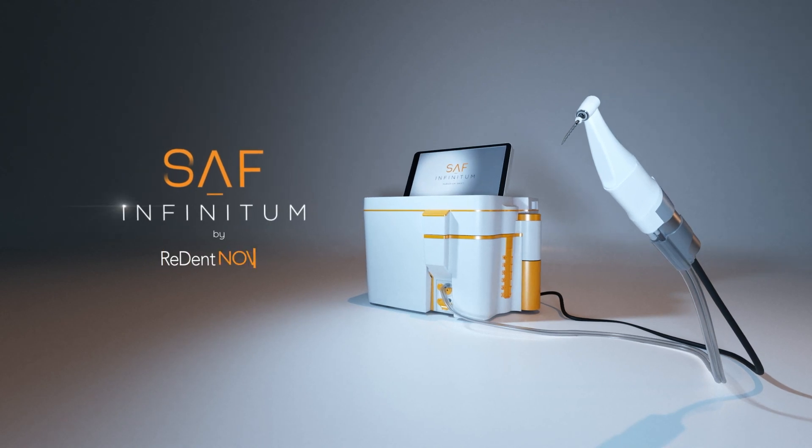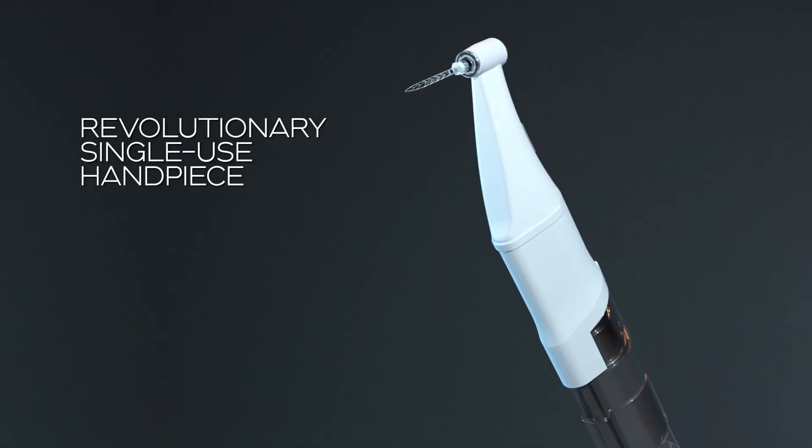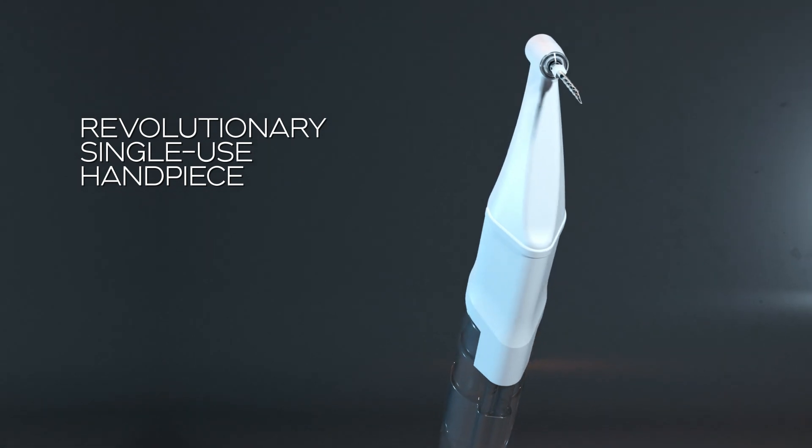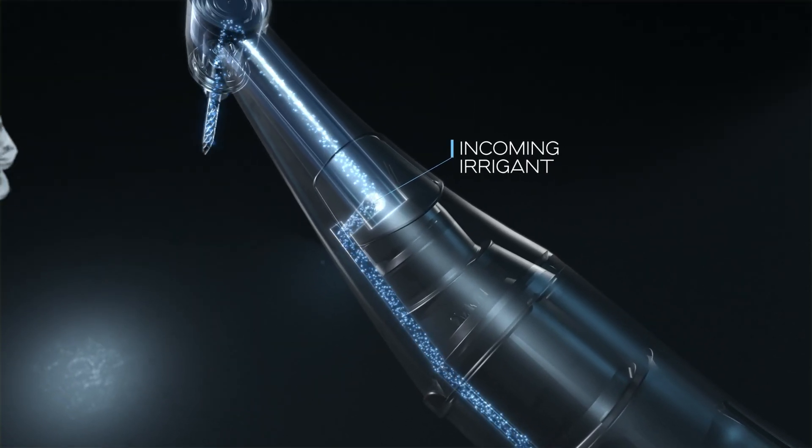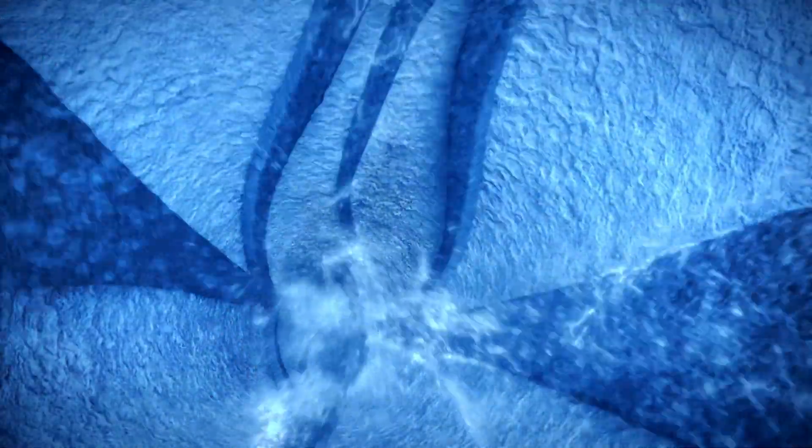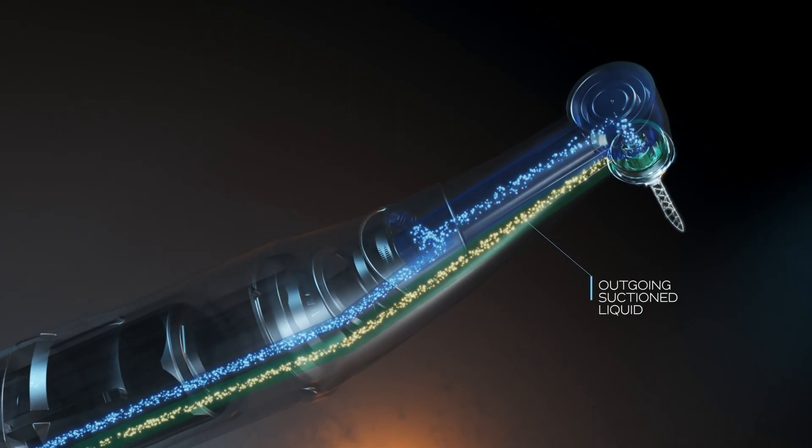SAF Infinitum provides the means to implement the SAF system philosophy. An advanced revolutionary single-use handpiece compatible with ISO-type digital micromotors consistently delivers the irrigation fluid from the main device directly into the self-adjusting file and intermittently suctions the excess fluids from the treatment area through a separate channel, clearing the treatment area for the dentist.